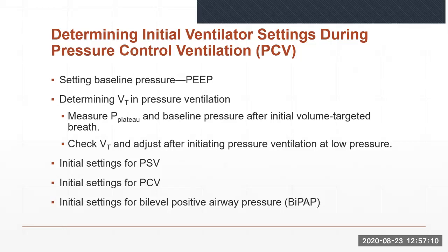Pressure-targeted ventilation is safe and well tolerated as an initial mode of ventilation in patients with acute hypoxemic respiratory failure and may result in greater patient comfort.